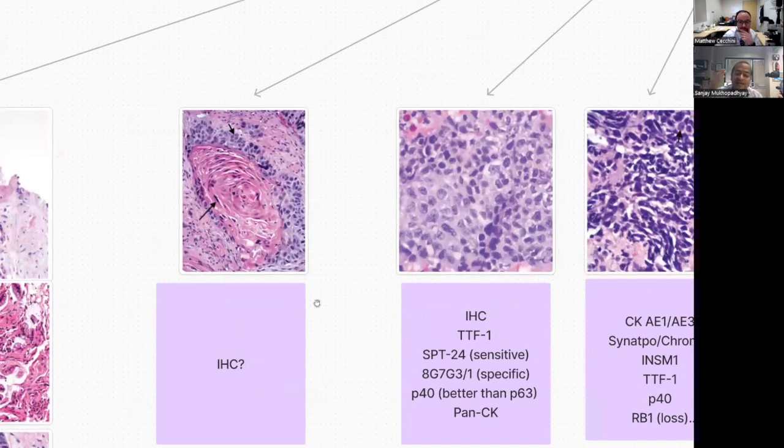So we are trying to say, is this squamous cell carcinoma or a urothelial carcinoma, both of which can be positive for P63, P40, and CK5/6. Also very important to remember GATA3. GATA3 can be positive both in primary squamous lung, this is well documented, and in metastatic urothelial. So I think the most helpful thing is if you do that panel and you have a P40 positive, diffuse positive, and GATA3 negative case, then you can be pretty certain that this is primary lung. But if you have any other result, it's inconclusive. If you have GATA3 positive but P40 negative, that might be useful, but I don't think that happens often.